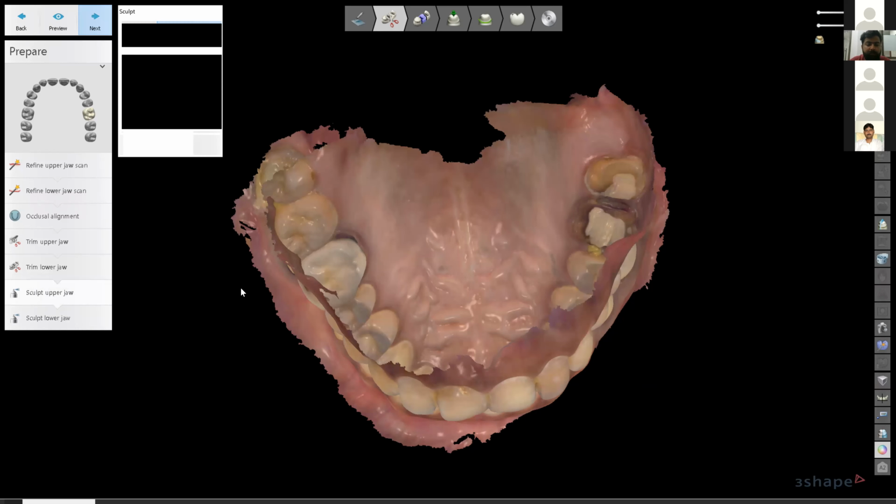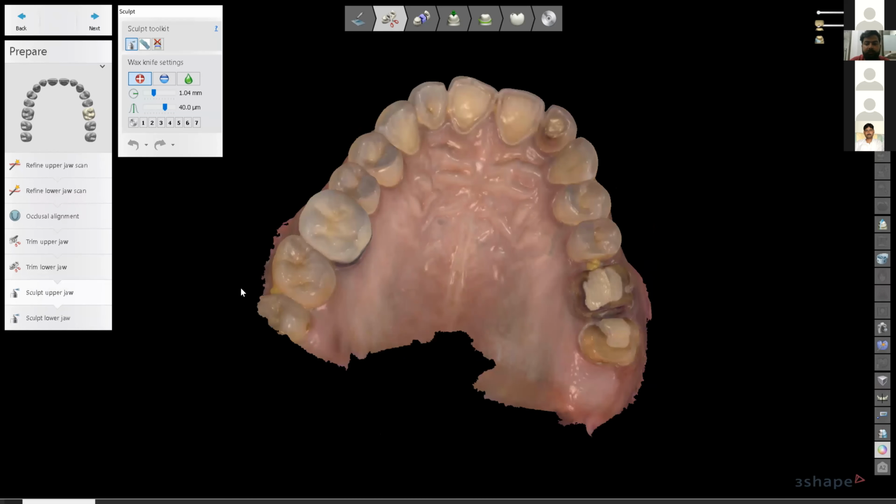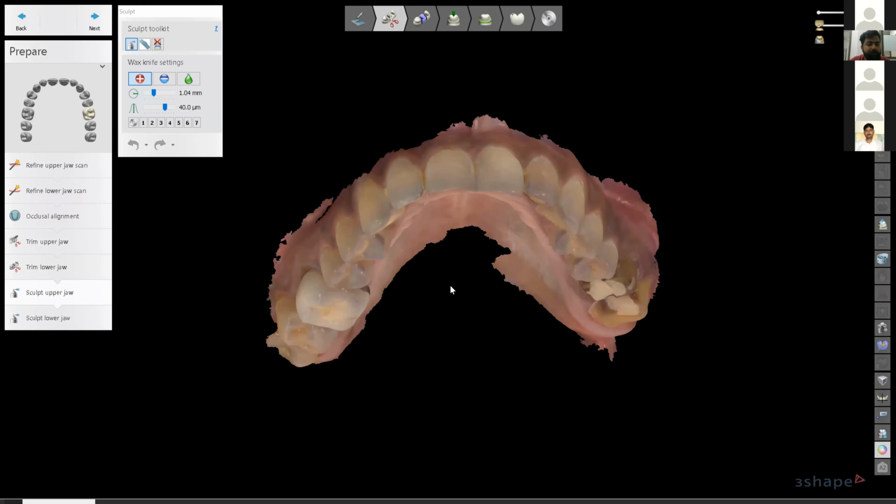Now, if it's an intraoral scan, yes, we know it's an exact scan taken by the intraoral scanner. But what if it's a scan taken by the lab scanner? As I said, we have to make the impression. The impression needs to be poured, and the poured model needs to be scanned. Now, if something is there on the impression, for example dragging or air bubbles, then the model also has the same air bubbles. What we do is sometimes we scrape it, or sometimes we don't.